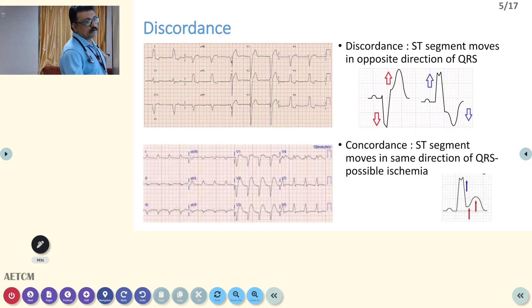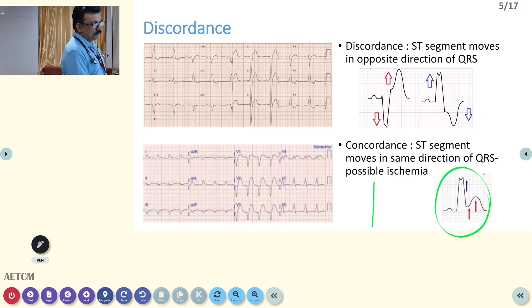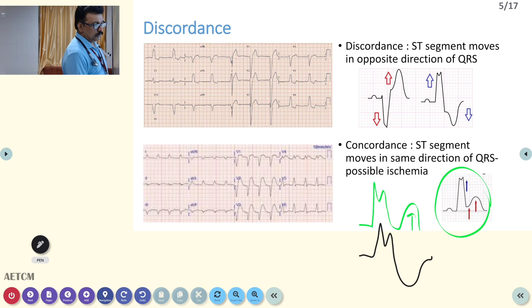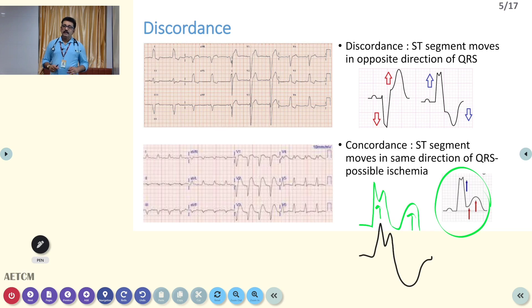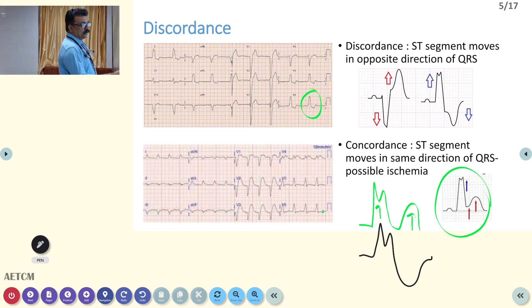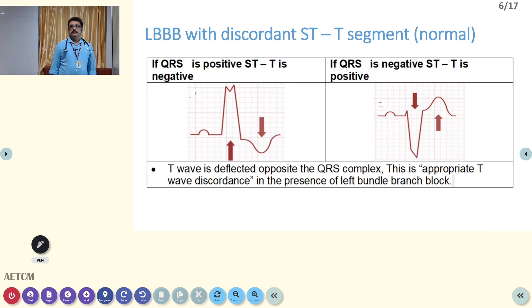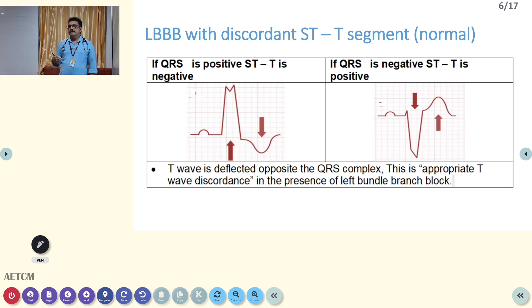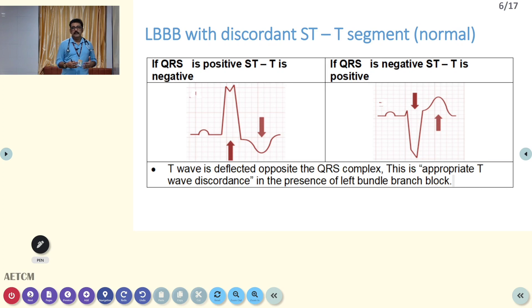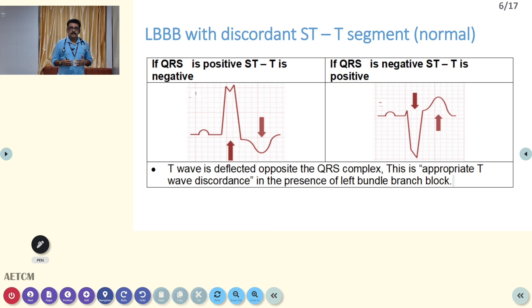In myocardial infarction or ischemic heart disease, it is concordance. With an M pattern QRS complex, you would normally expect the ST segment to be downsloping, but in MI both the QRS and ST segment are positive — that is concordance. This is a classical finding in ischemic heart disease, especially myocardial infarction. If you are seeing concordance in the ST segment, that alone is sufficient to make a diagnosis of acute myocardial infarction.